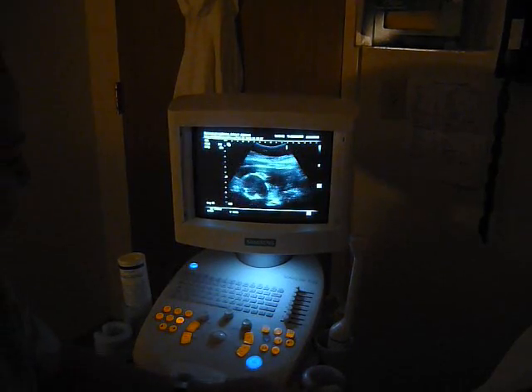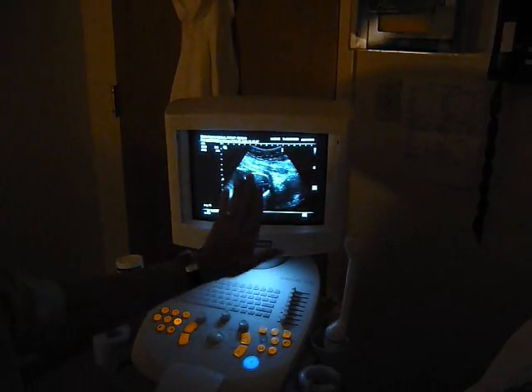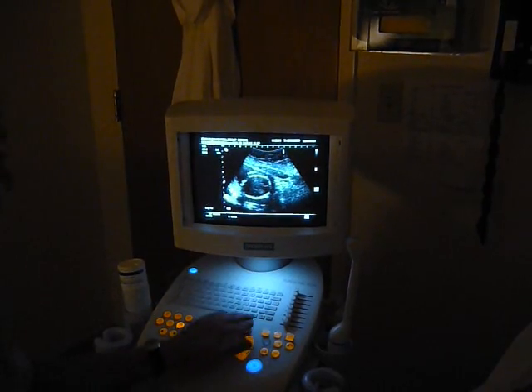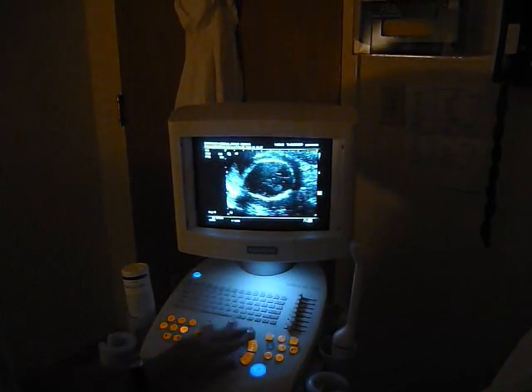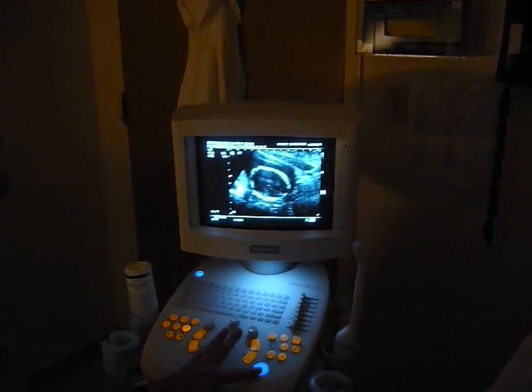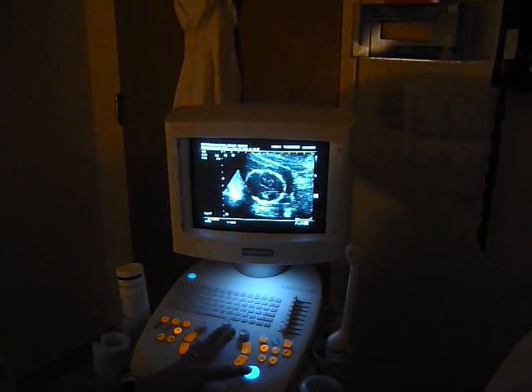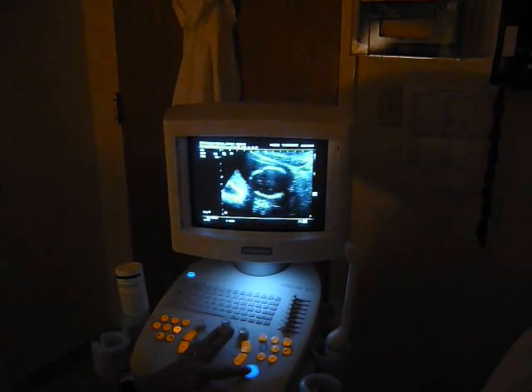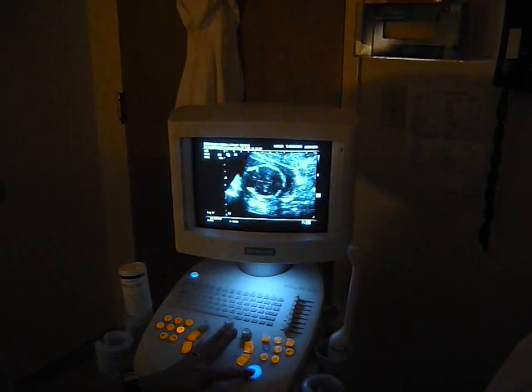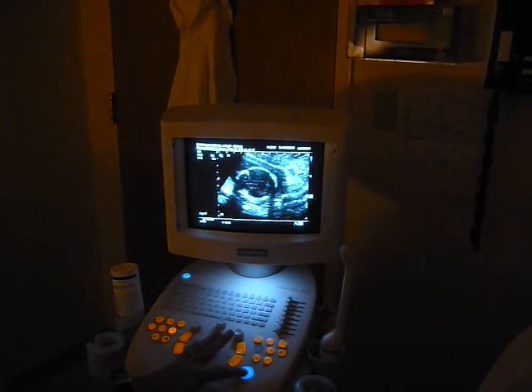Come on, baby. Help us out here. You got his head down right now? Uh-huh, yep. We're looking right down on the top of the head with the front of head and back. Good for his head. Look at the spinning around in there. I'm telling ya. Oh, there's some cartwheels. Tell us where the bar is, because it's a clearer picture. Oh, it's a more clear picture than... Oops.